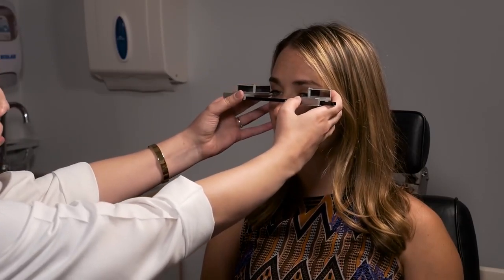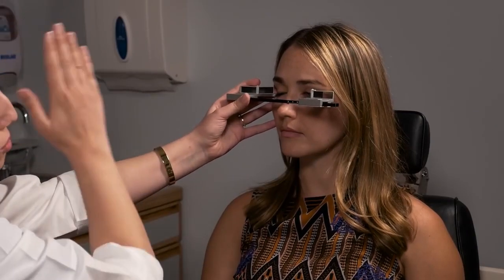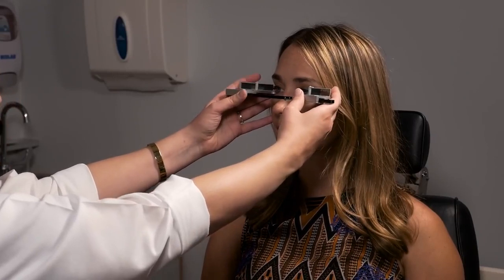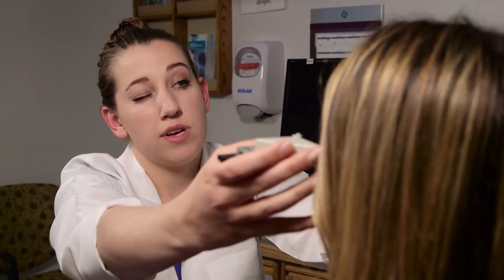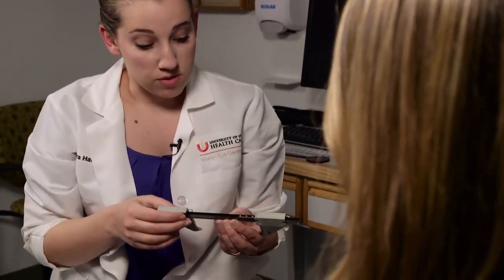So while the patient is positioned that way, you close one eye, look in the mirror, and you'll see two red lines. The point of the red lines is to eliminate parallax. So you line those two up when you're taking the measurement. You look in the mirror, and you can see the corneal apex. And so you just use one eye open, ask the patient to look at your open eye, and you mark in your head where the corneal apex falls. You do the same thing on the other side, and you always want to make sure that you take the base measurement. This is the distance between the two index points.